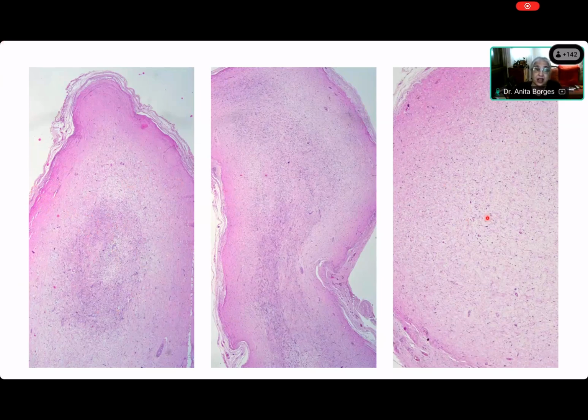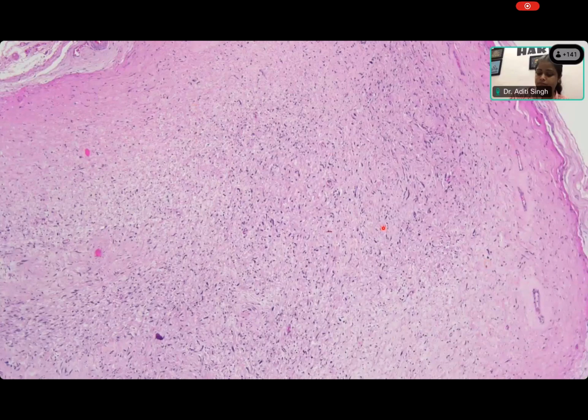And it's very unevenly cellular as well. Look at the cellularity on the right hand side. Very, very almost acellular in some of this. Now we can go to the periphery. You see the collagen of the periphery, all right? And then you come towards the center. Yes, there is collagen, but it's becoming also more myxoid. There you are. Okay, so now come on, describe this.